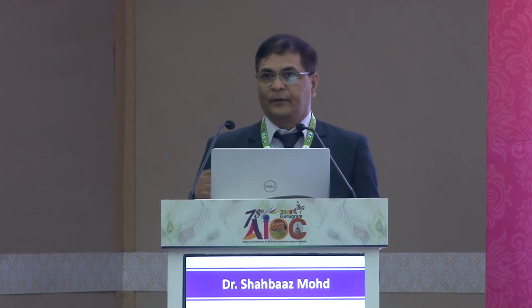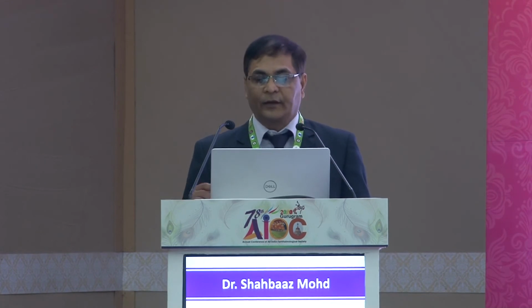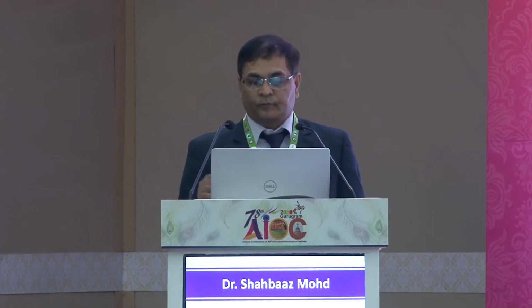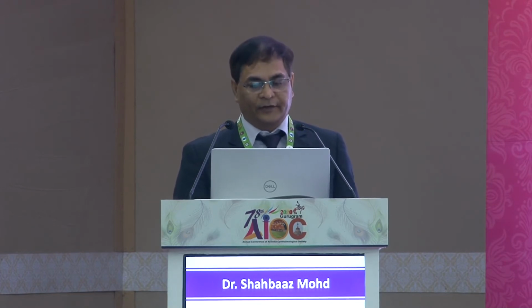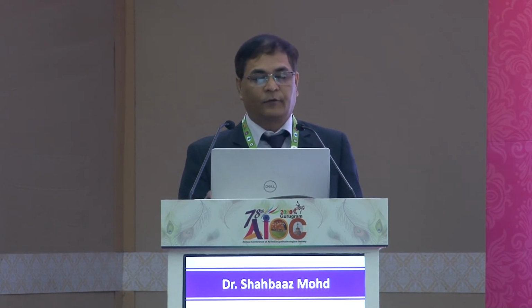Gain has to be changed depending on the density of the cataract, because the echo may cause a change in the axial length. So we have to increase the gain if the cataract is dense or hard. And if you are doing manual, a minimum of 3 readings should be taken, and then average them from those 3.